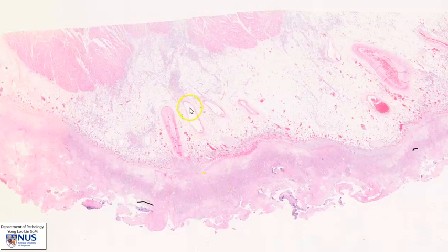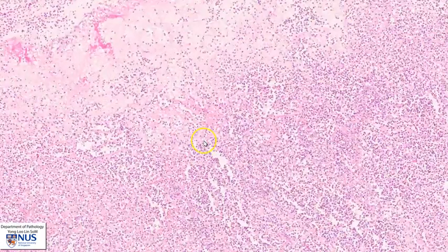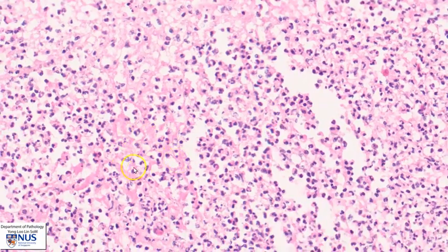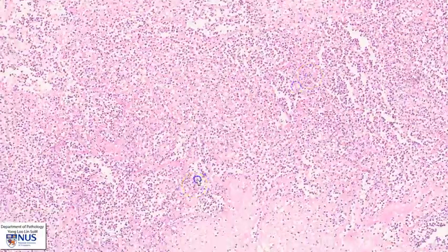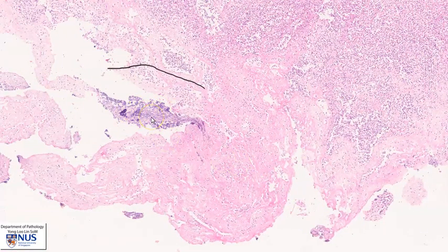In summary, here is a virtual microscopy slide of purulent or infective pericarditis, where we can see this thick layer of pus or purulent exudates overlying the visceral pericardium, composed of numerous neutrophils or acute inflammatory cells admixed with strands of fibrin as well as necrotic cellular debris. And the cause of this is usually bacterial, and the treatment is drainage with systemic antibiotics. Thank you.